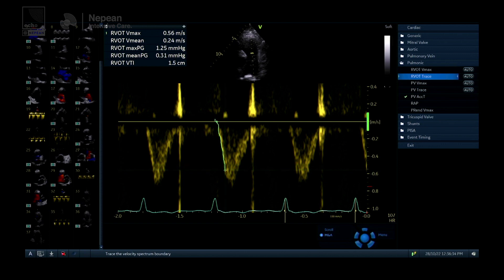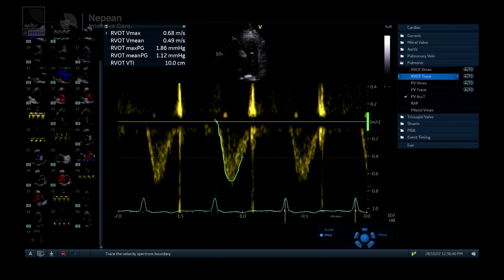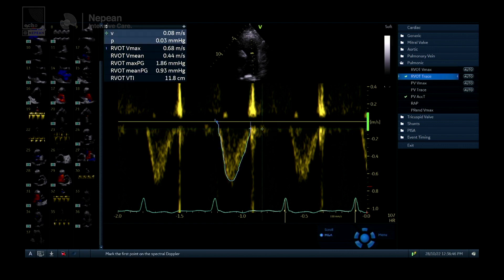RVOT measurement is particularly useful when you can't get the LVOT trace, or when the LVOT won't be accurate — for example, in patients with LVADs or on ECMO where you can't rely on LV outflow. Also, if you see an RVOT VTI that is much higher than the LVOT VTI, go looking for a left-to-right shunt, such as an ASD or VSD.